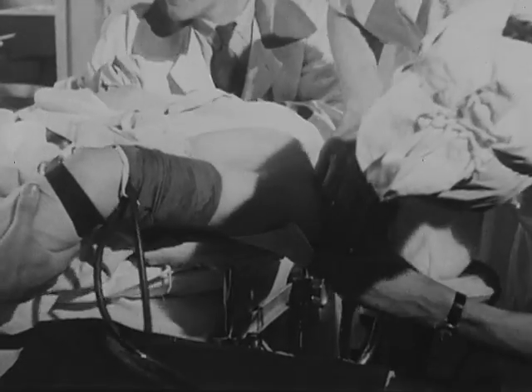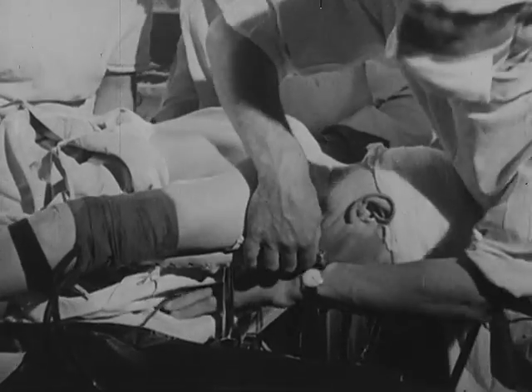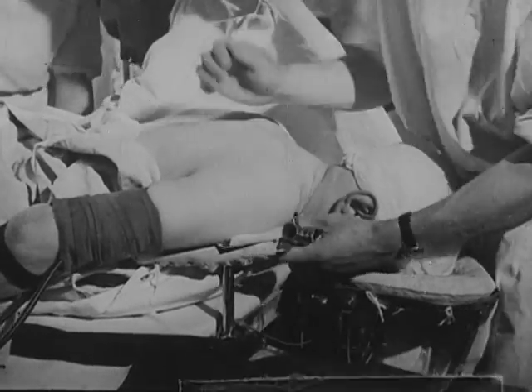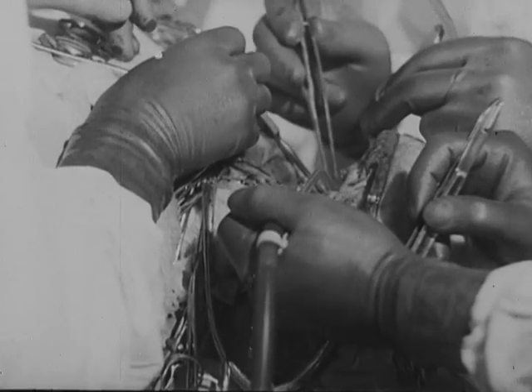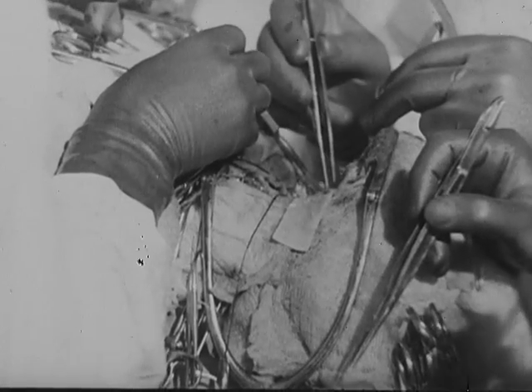Here is a patient being placed in the prone position for a craniotomy. Notice that the anesthetist does not lose his hold on the tube while the patient is being moved. Also note that endotracheal anesthesia is of the greatest advantage to the surgeon in helping him to maintain strict asepsis.